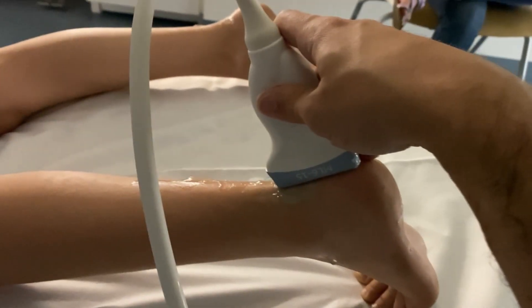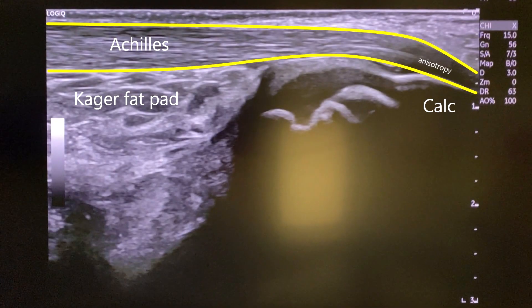I like to begin sagittal by the calcaneus and work my way superiorly. Here you can see the Achilles tendon, the Kager fat pad, the calcaneus, and a little bit of anisotropy due to the angle of incidence from the ultrasound beam, not to be mistaken with actual hypoechoic or edematous tendon.